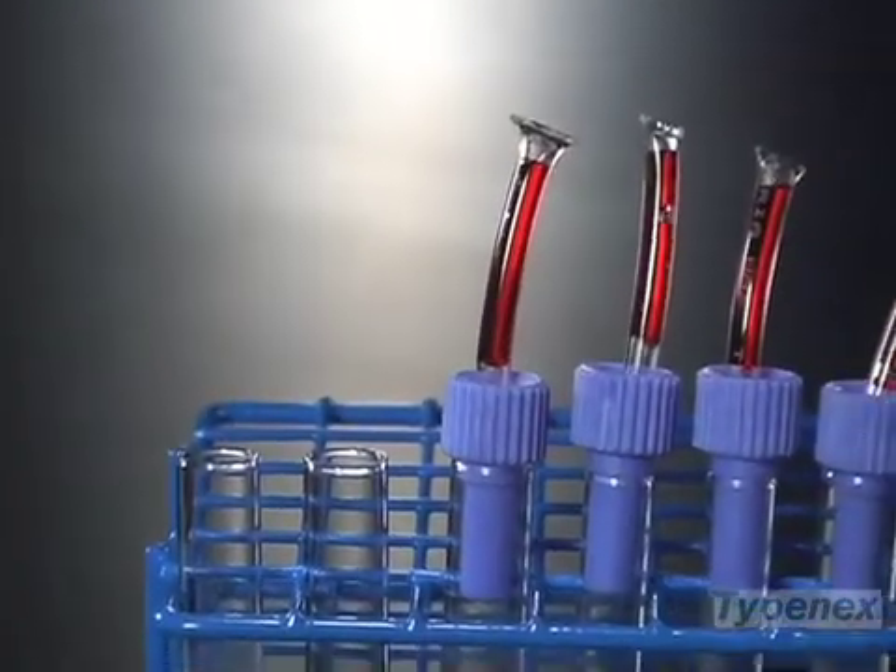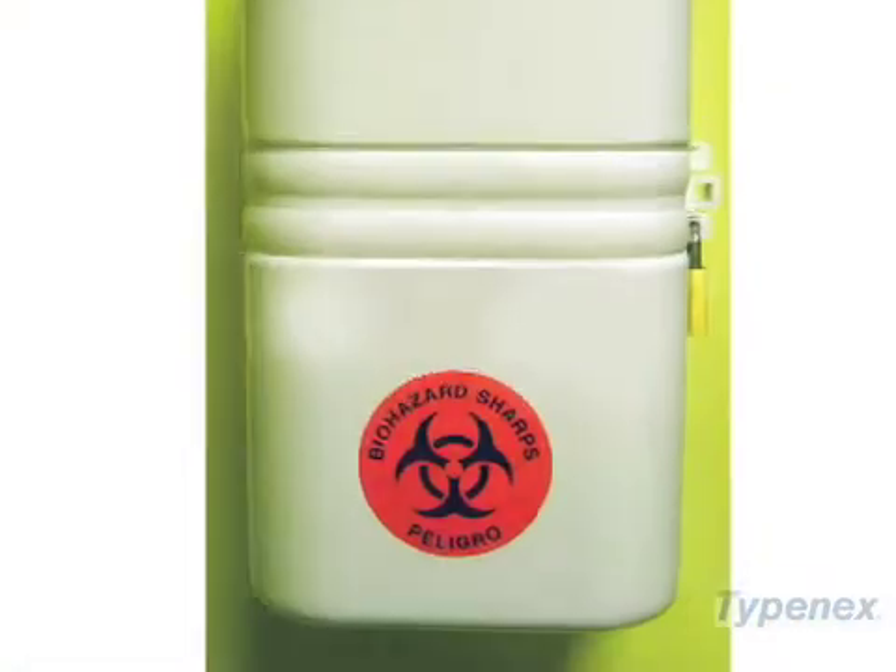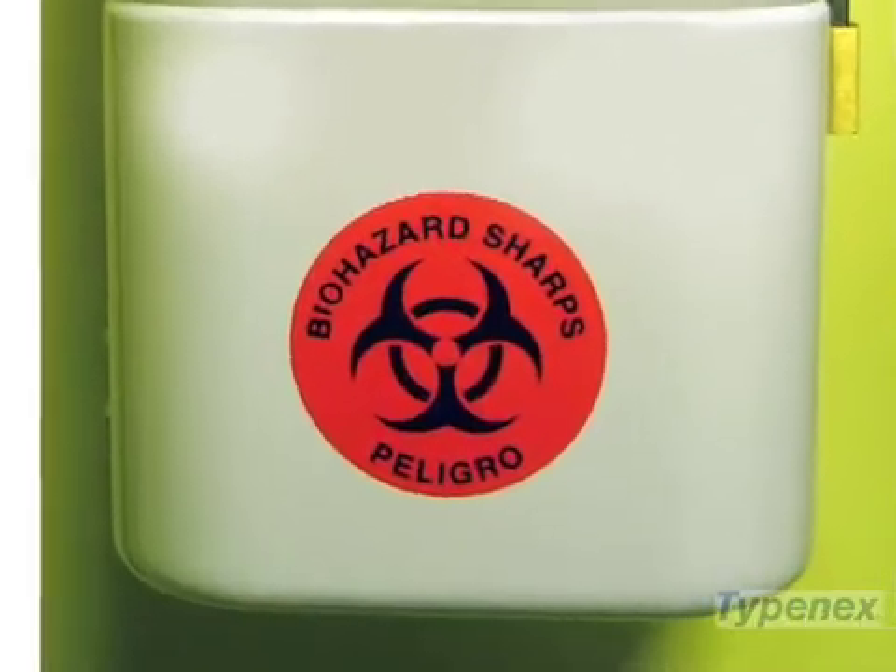When the desired sample has been dispersed into the test tube, remove the blood segment and the Typesafe device. Properly dispose of both items in designated hazardous medical waste receptacles.